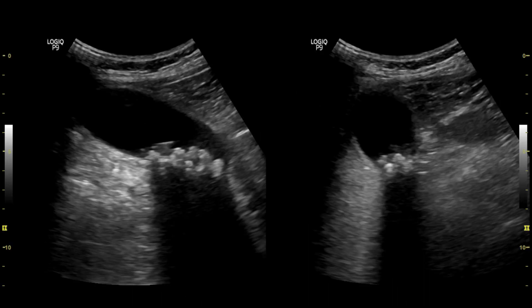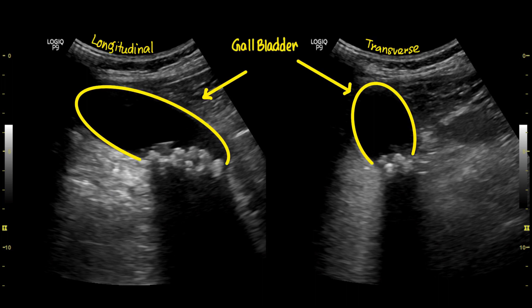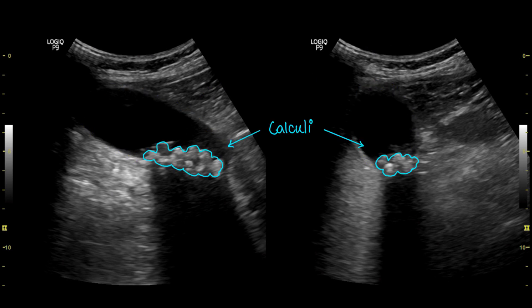Here you can see the gallbladder in longitudinal and cross sections. Internal hyperechogenic structures are casting posterior acoustic shadows.